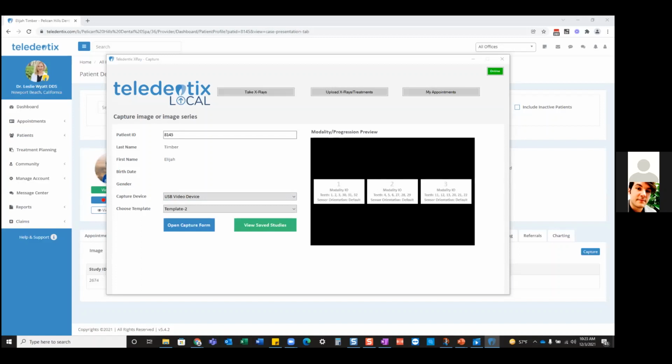And again, just to reiterate, the reason is there is so much added functionality with this release that updating the previous version is not going to cut it. The previous version was not built to supply such functionality. So we will have to go through that sequence that James was amazing enough to demo for us: uninstall, clear the app, and then reinstall fresh. So definitely book those sessions with us, guys, if you have additional questions, and we can help you with that.